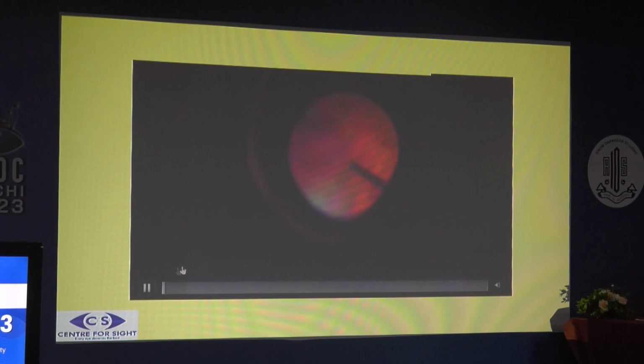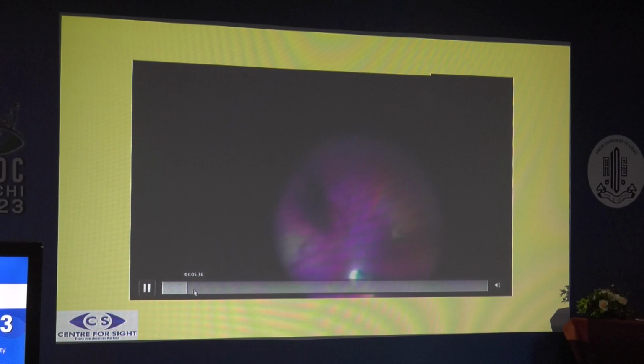patient who has had vitreous hemorrhage. Again, the main aim is first to do core vitrectomy and then try to make a hole in the hyaloid if you can. Once you make a hole in the hyaloid, the entire retrohyaloid blood starts coming out if it is a loose blood, and you can employ a suction, gentle suction. Don't pull too much at this time.